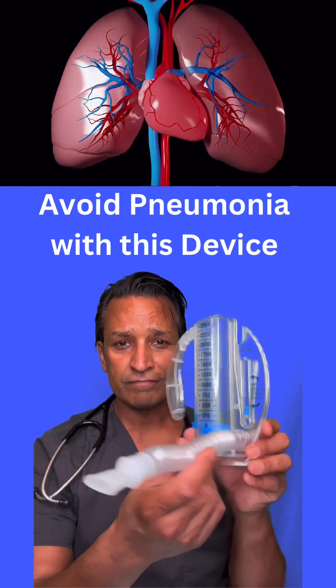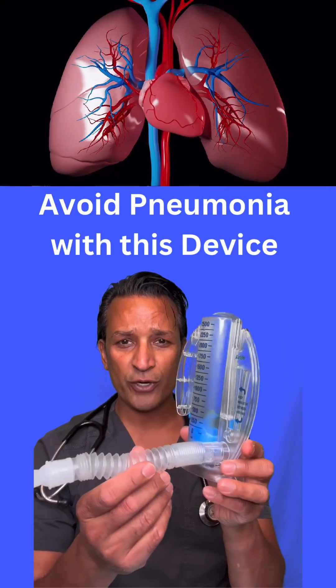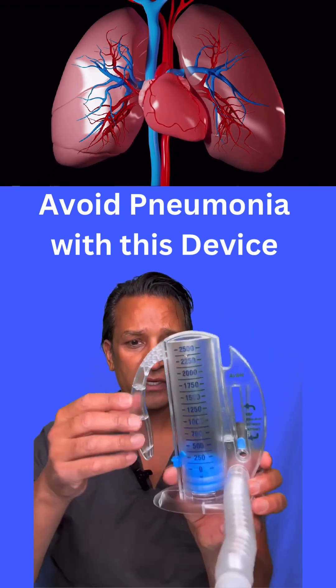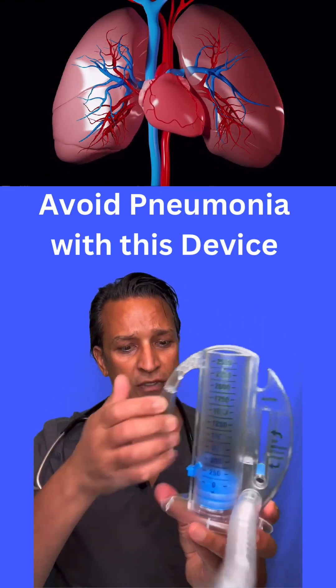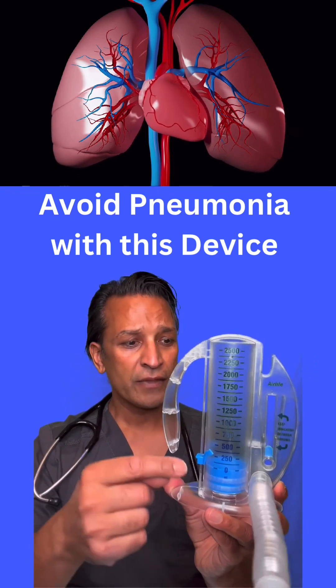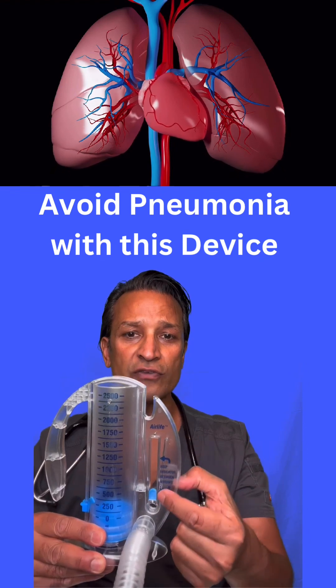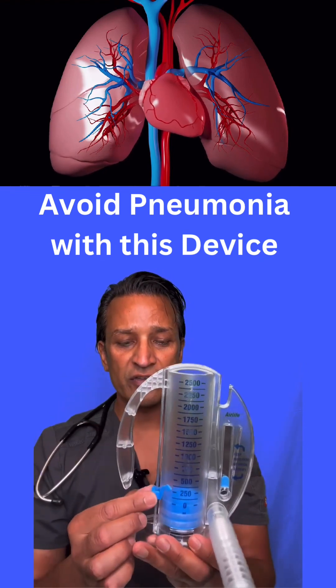Does anyone know what this is? It's an incentive spirometer. So what do you have? You have the mouthpiece, you have the tubing, you have the handle, you have the piston, which is the blue piece inside. And then you have this flow meter right here, this little blue piece that's going to float up. And then you even have this little gauge.